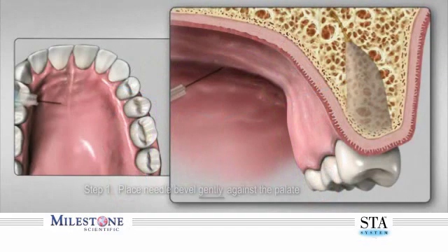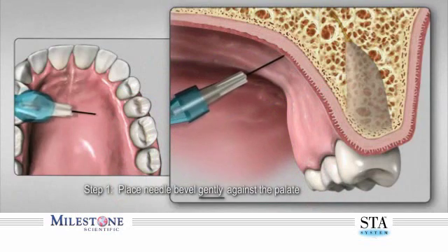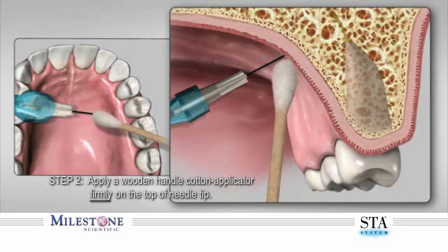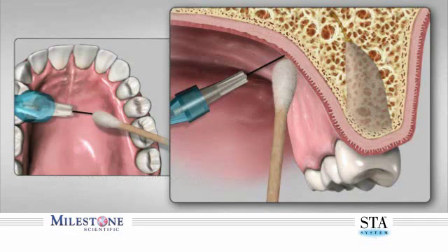Step one: start by gently placing the bevel of the needle against the surface of the palate, holding the handpiece at approximately a 45-degree angle to the palatal surface. Step two: stabilize the needle by applying pressure from a cotton applicator. It's best to use a wooden-handle cotton applicator so that adequate pressure can be applied. The applicator absorbs any excess anesthetic and makes for a more comfortable needle entry.